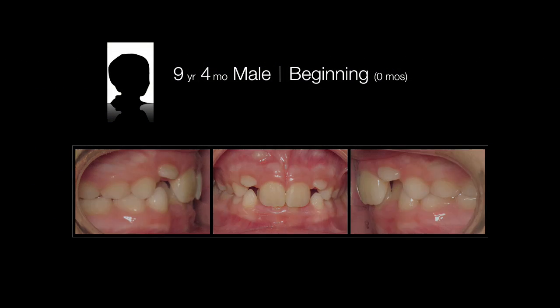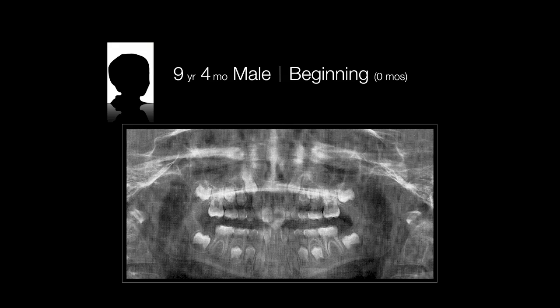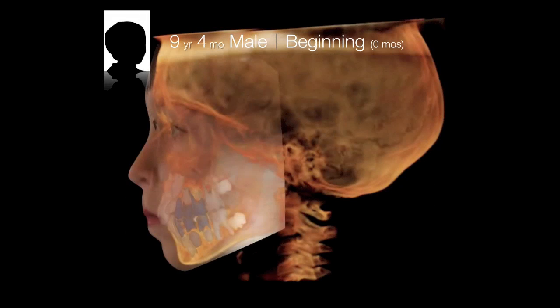We're just going to talk about this 9.5-year-old with moderate crowding in both the upper and lower jaws. Most of us would see this as a relatively routine mixed dentition case. When we look at the panoramic X-ray, you can see the maxillary canines erupting mildly ectopically. I think most orthodontists would look at this imaging and say this is a routine case. We don't need to get further imaging. Let's just make sure that we treat this appropriately based on what we're seeing with the maxillary canines, but they don't look as though they're severely off course.